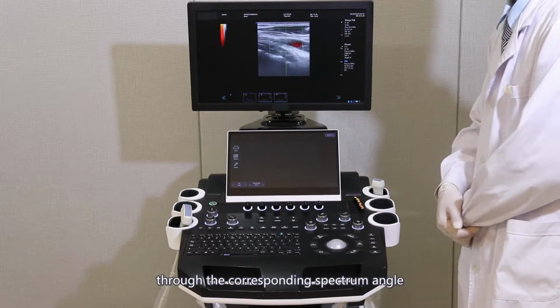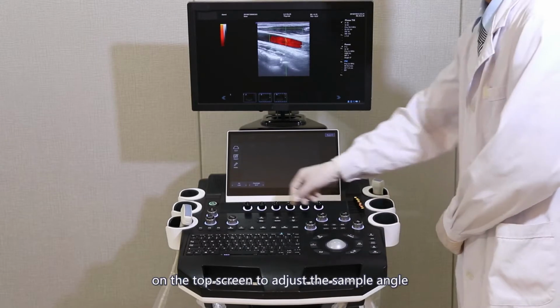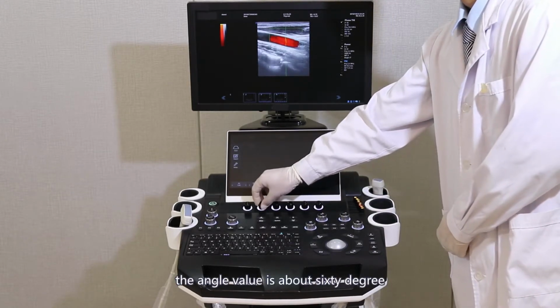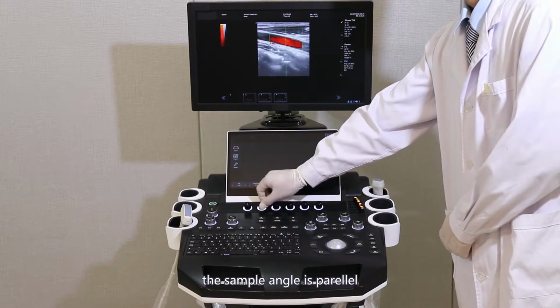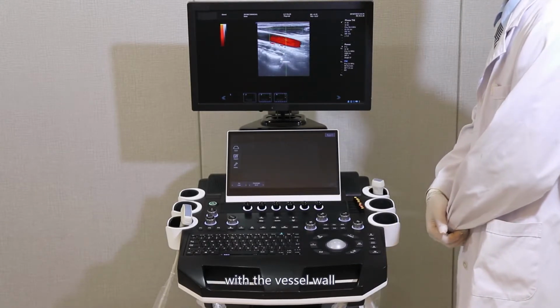Use the corresponding spectrum angle knob on the touch screen to adjust the sample angle. The angle value is about 60 degrees. The sample angle is parallel with the vessel wall.